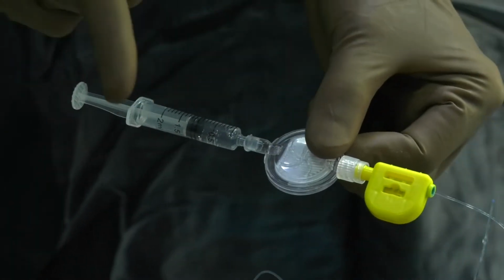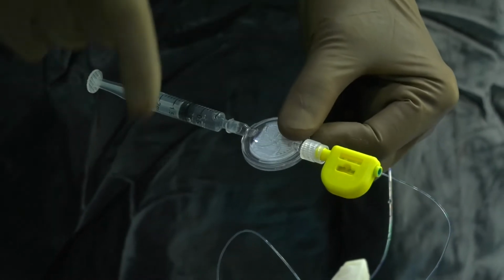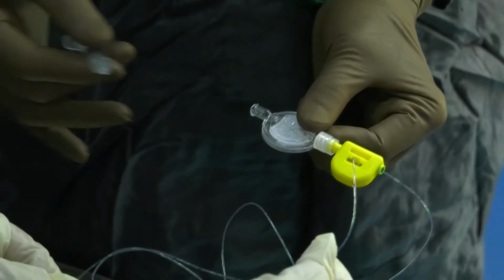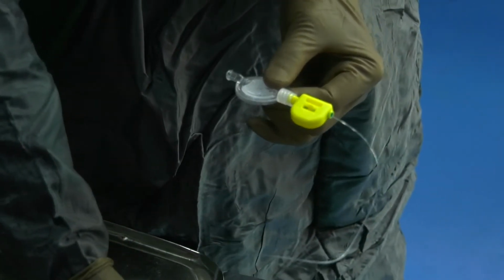This is the total dead space you have to take into account, because whenever we inject the drug through this epidural catheter, 1 ml will remain inside the catheter. This drug will be washed out when we insert the catheter, so no need to worry during the first insertion, when you give the first dose.